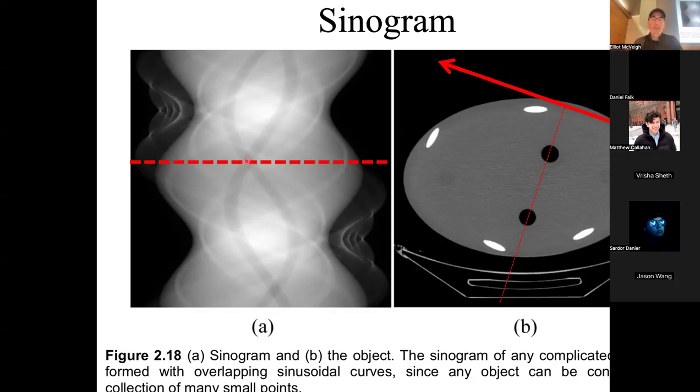Now you can look at GL theta and ask, what the heck are these points? Do they mean anything, or how do you parameterize them? Well, you can see that this one and this one, when you plot it out, are basically a sine wave, an oscillation. As we rotate our detector and our source, and I look at any point in this plane, what I'm going to see is a sine wave as I rotate around there.